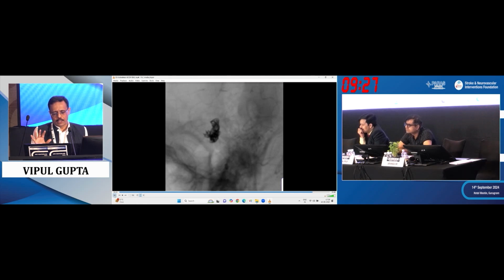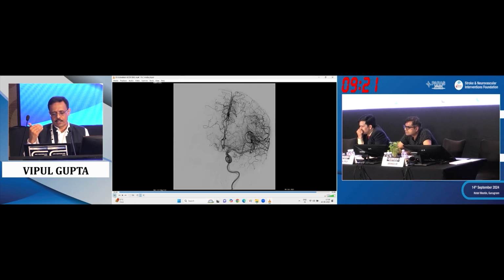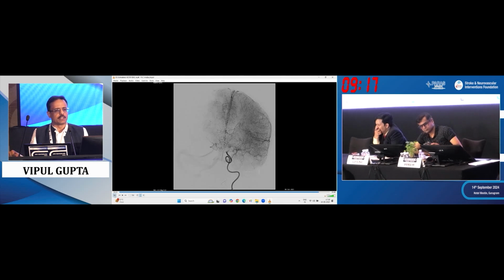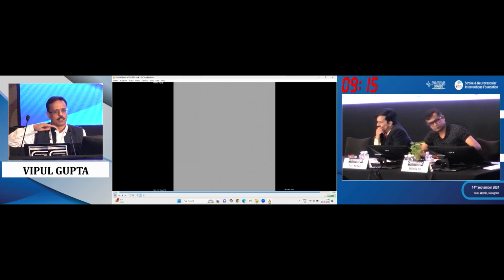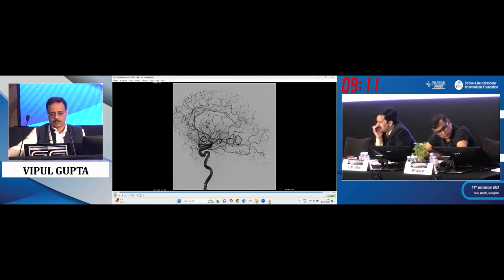So we really like to be sure that all the lobules are thrombosed. So we know if you have to give more drug and heparin, now it's safe. So at this stage, we just increase the heparin because we want to avoid the antiplatelet agents if possible. So in aneurysms, our heparin level, we keep increasing. At this stage, we want our ACT more than 250 for sure. Of course, we check all the vessels.